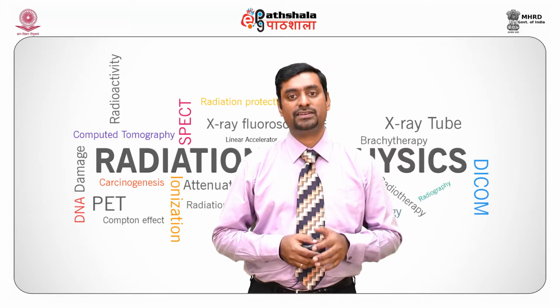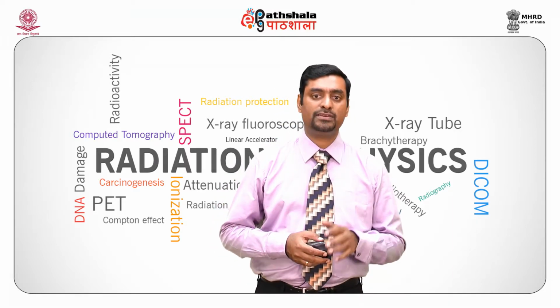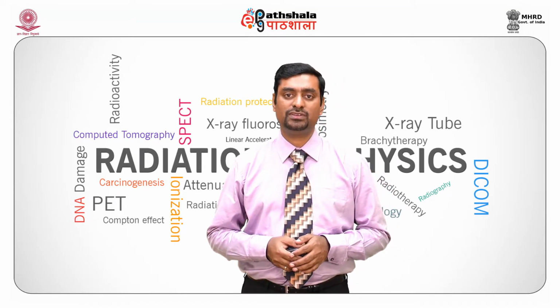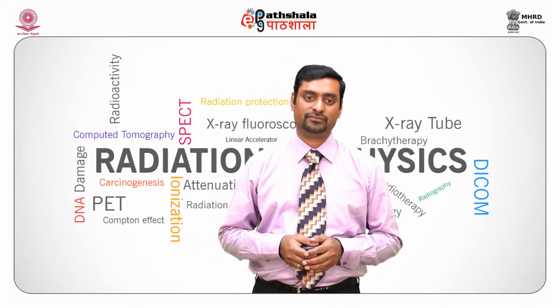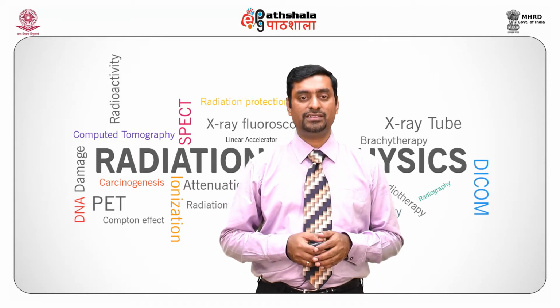As transmitted X-rays are absorbed in selenium, electron hole pairs are produced. The number of charge pairs is proportional to the incident X-ray. This charge forms the digital signal used for creating the image.